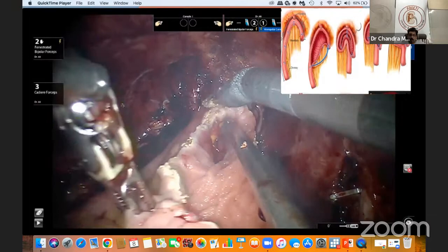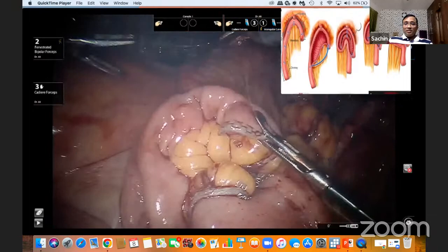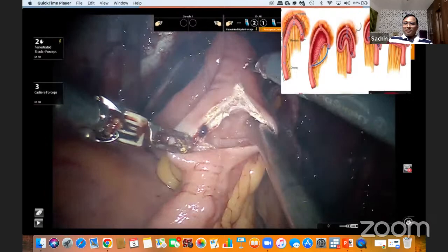A lot of suturing is involved. For that suturing, again, V-Loc or Stratafix, anything. 10 centimeters of chimney is left, and the rest of the 30 centimeters is to be used on this side also. Is it better to always measure, or approximate? No, I measured initially. So 10 to 12 centimeters is sufficient.